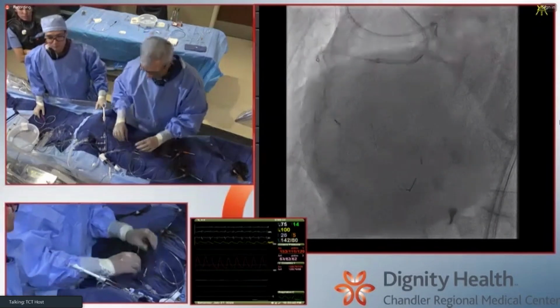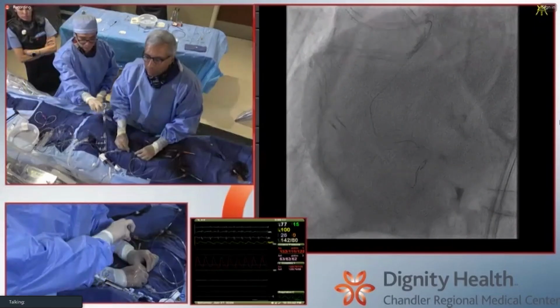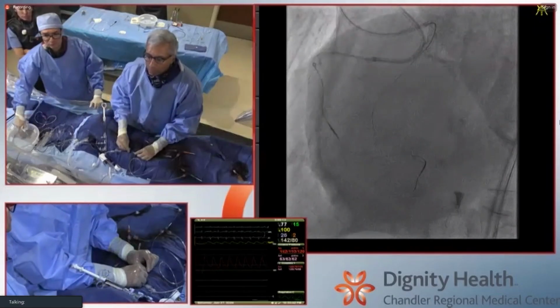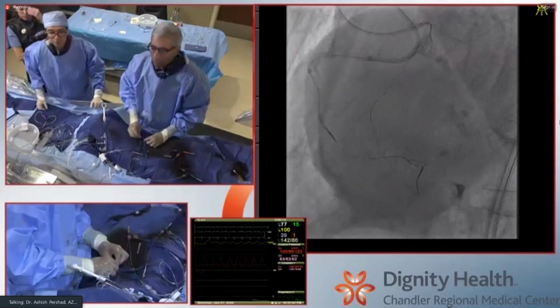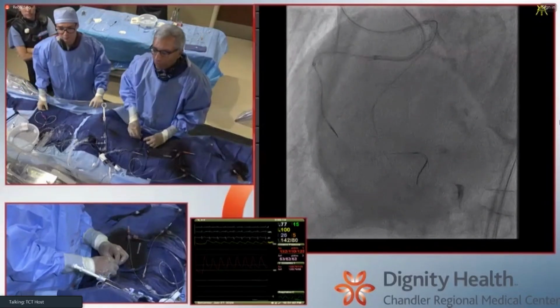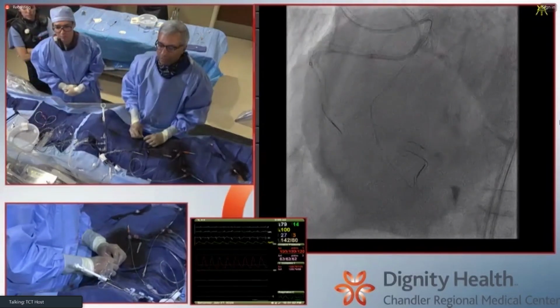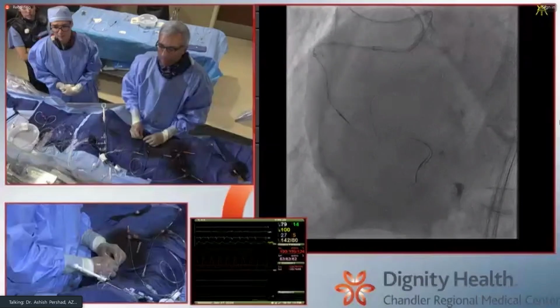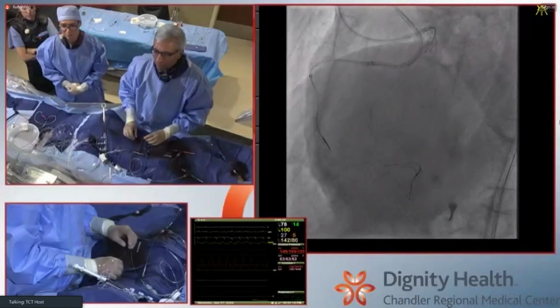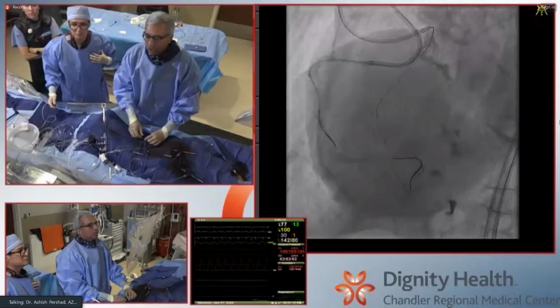Just don't lose your retrograde wire there. No, I'm not, I'm just pushing it. It really feels free. It looks pretty good. Just maybe take that retrograde now and satisfy everyone's curiosity, but I think you're there. Yeah, retro injection, inject.